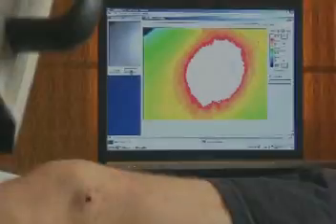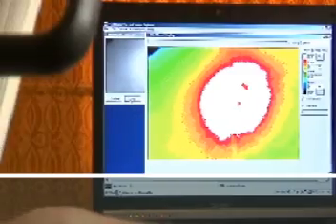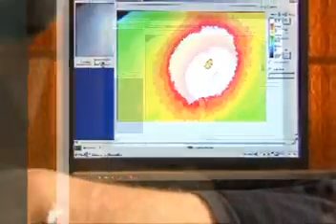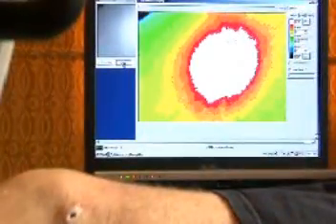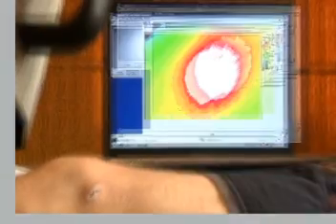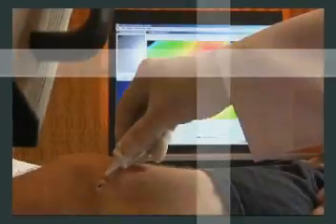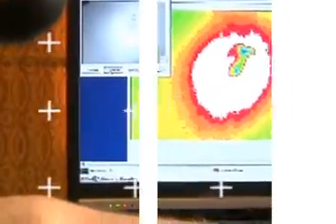Look in that cabinet over there. There's a box. Let's go ahead and start it. Got it? So basically we put it on here. We're going to put it on this thing. Not too much on the skin because it'll burn the skin. And then we'll just wipe it off. There's a little bit like the biopsy hole. Okay. We're going to put a band-aid over it with a little antibiotic cream. We could actually do it with a little skin cancer, but it's so small that it's just no sense in doing it.